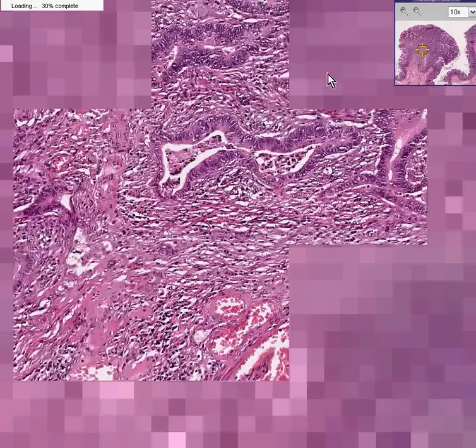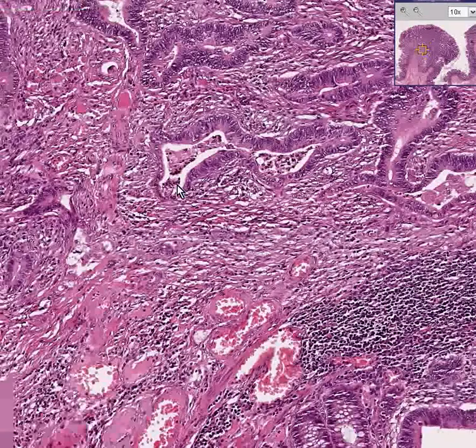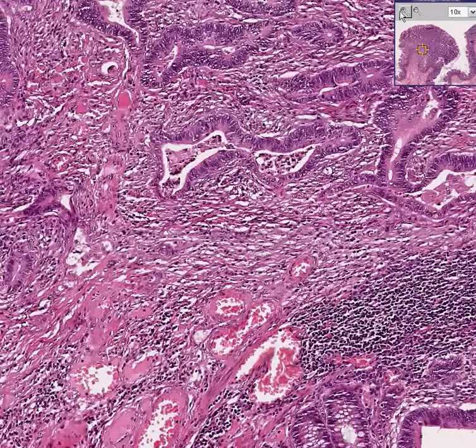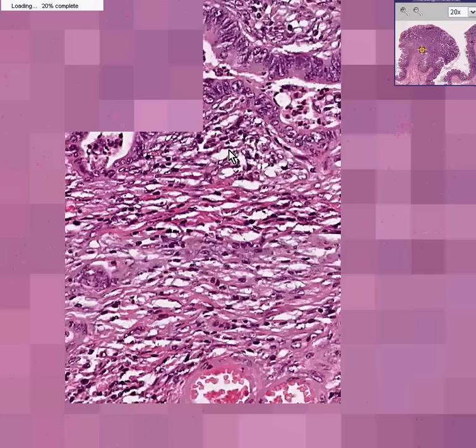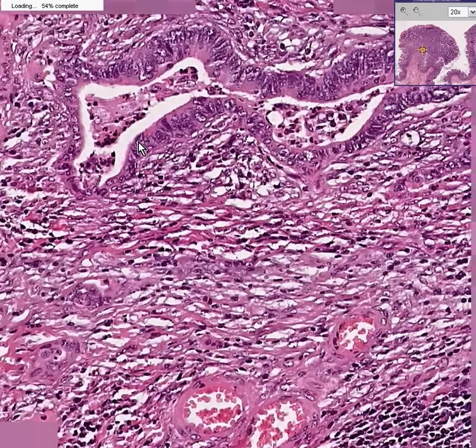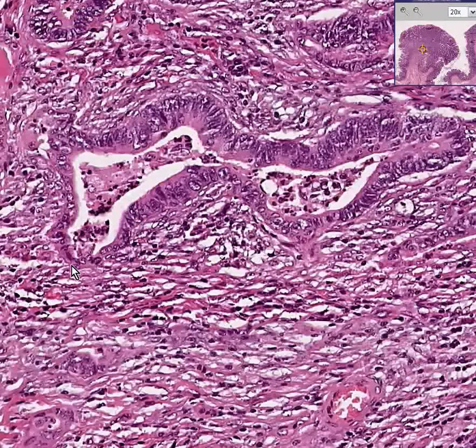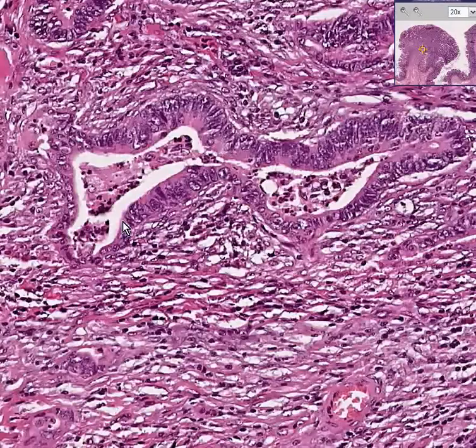So this is very clearly an example of irregular malignant glands from a malignant change within an adenomatous polyp, now invading into the stalk.